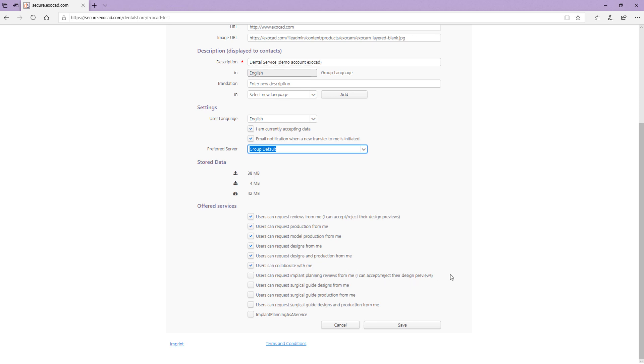To save your changes in the My Accounts tab, click Save. Or click Cancel to discard your changes.